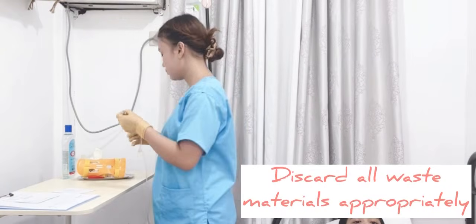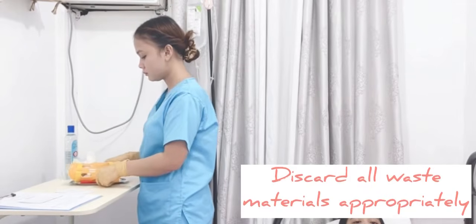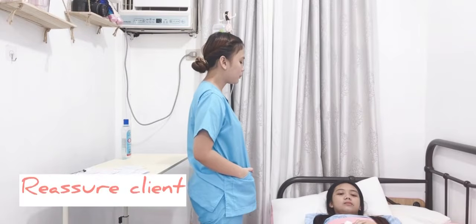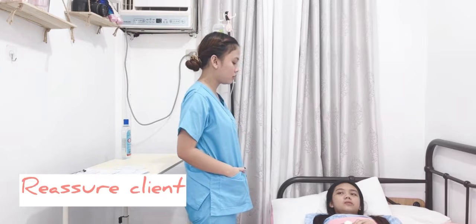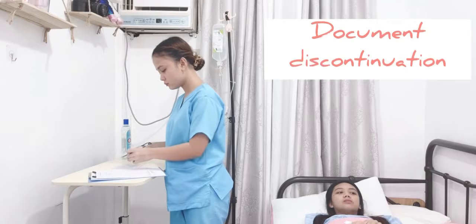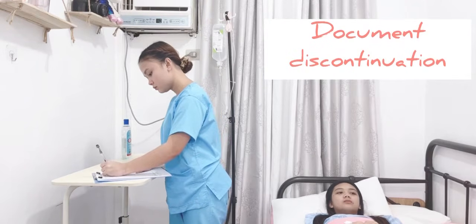Then discard all waste materials appropriately to reduce transmission of microorganisms. Then make sure to reassure clients. Wala po ba kayong kakaiba or may masakit po sa inyo after po nung sa gamot po? Wala naman po. Okay po. Then wash hands to reduce transmission of microorganisms. Then document the discontinuation. It indicates the date and time and the reaction of the client to the medication.